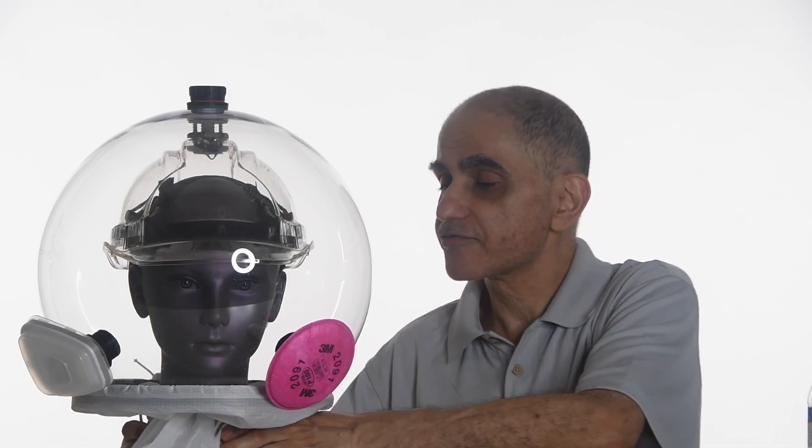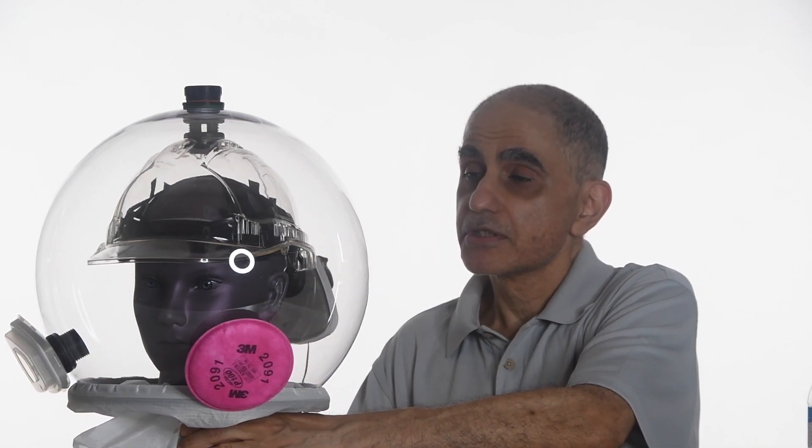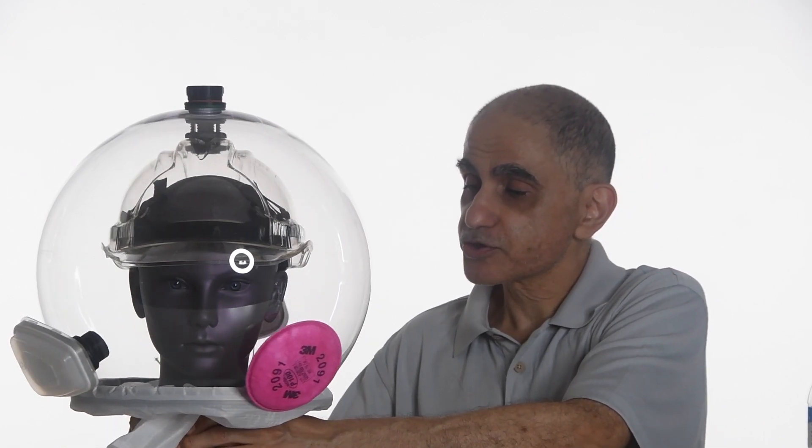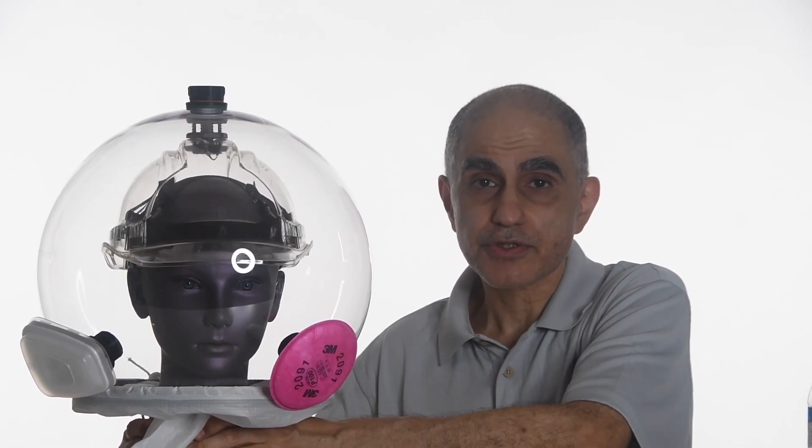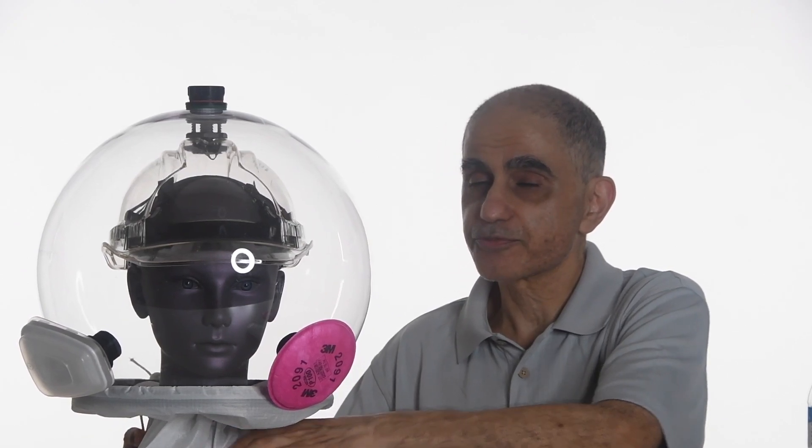And then the filtration happens via an air pump, suction pump, which is in the back. This is an early prototype of it that also filters the air going out. So that's important, because basically you're protecting people around you and not just protecting yourself.